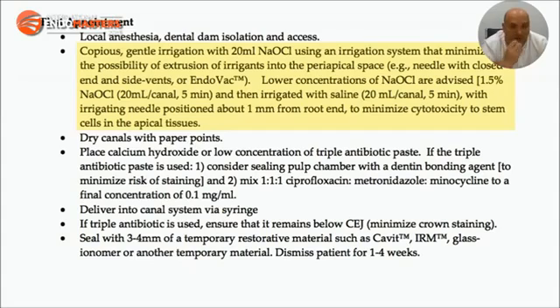For interim dressing, they suggest calcium hydroxide or low concentration of triple antibiotic paste, and if triple antibiotic paste is used, consider always to seal the pulp chamber with a dentin bonding agent in order to minimize the discoloration effect of the minocycline component of the triple antibiotic paste.